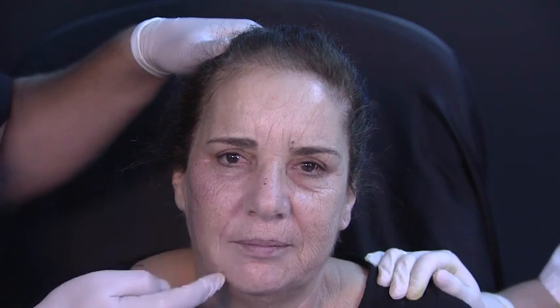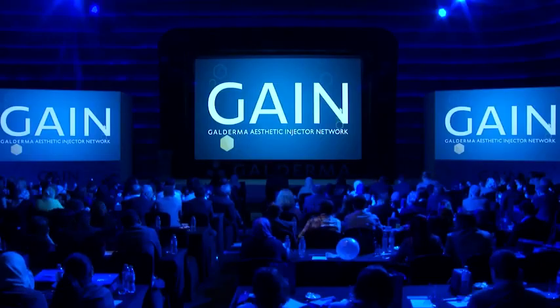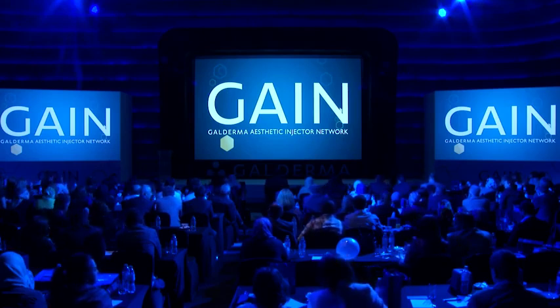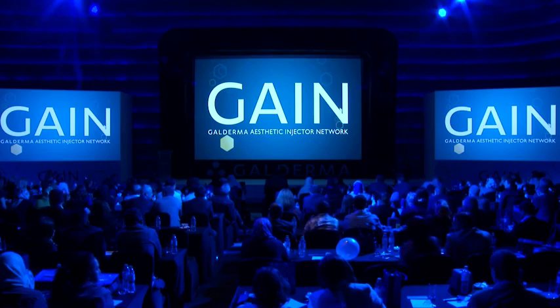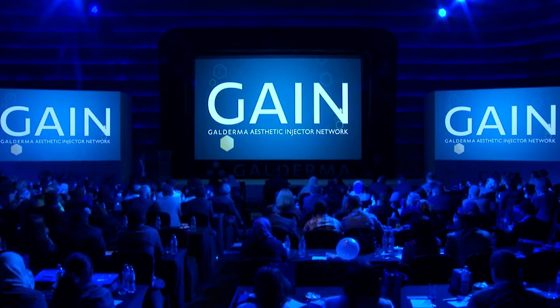But listen, the teaching thing here is look at this improvement without over volumizing. I insist. This is why I'm so excited with these products. And I went back to Nasha technology, that these were the products that I started 17 years ago, injecting here and here. And I left them because it was the fashion of the volumizers. And now I realize the magic that we can do with Nasha again in this type of patient. And then the one next that we have. This is not finished. Come on, let's change.